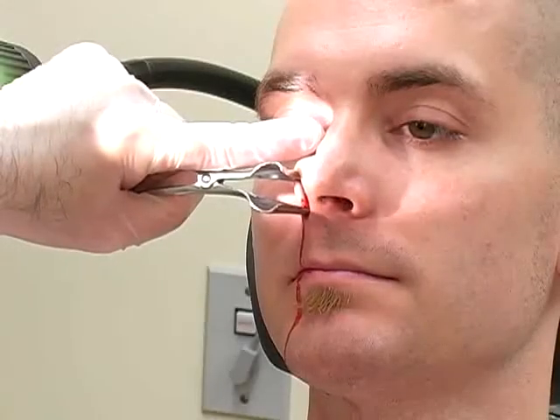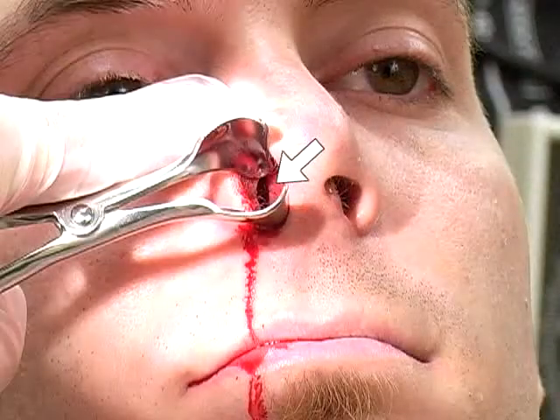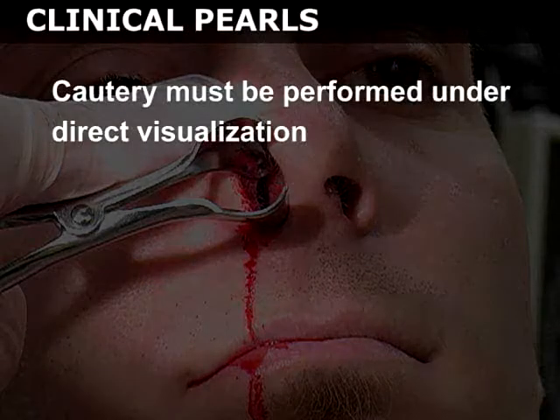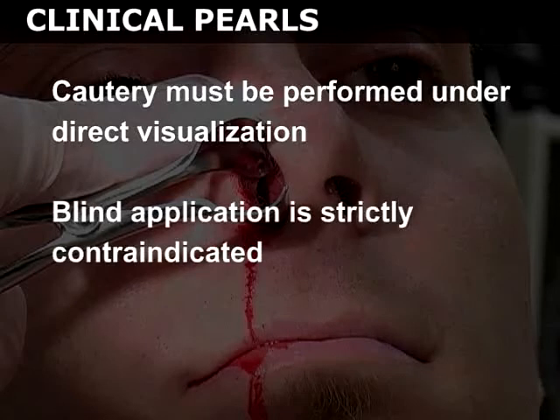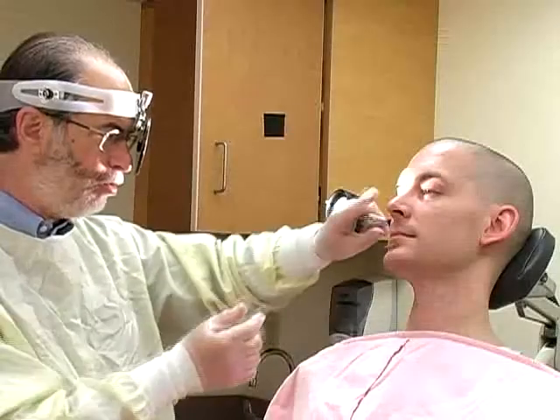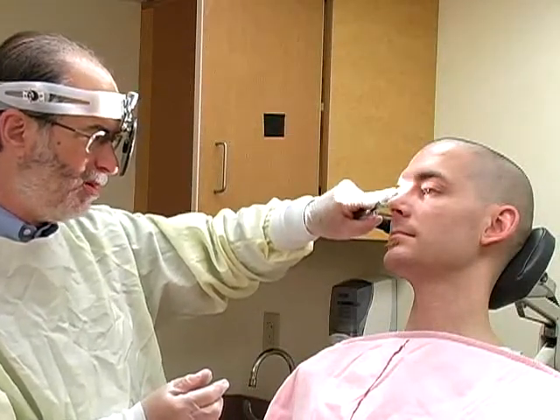If a source of anterior bleeding from Kisselbach's plexus is identified, you may attempt to cauterize it directly using silver nitrate. This technique must be performed under direct visualization, and blind application is strictly contraindicated. Hold the nasal speculum in your non-dominant hand and spread the nares vertically.